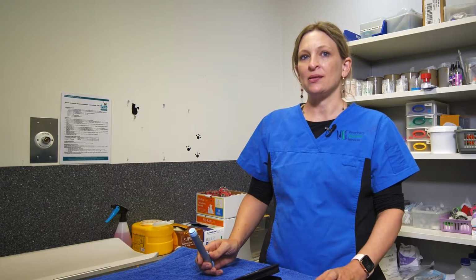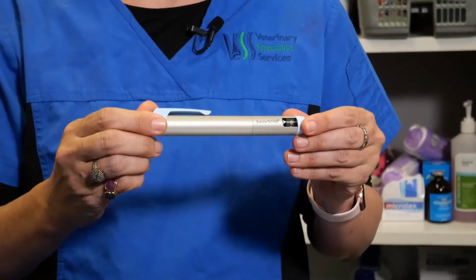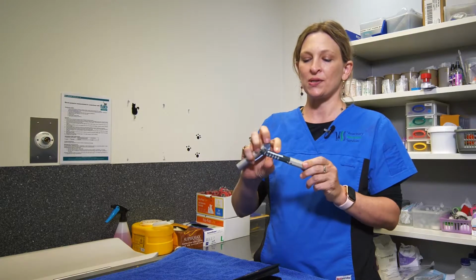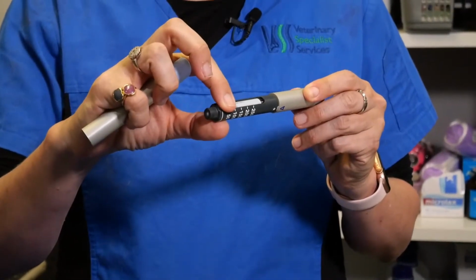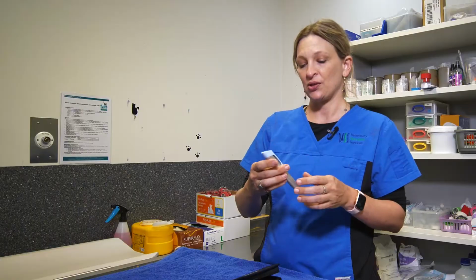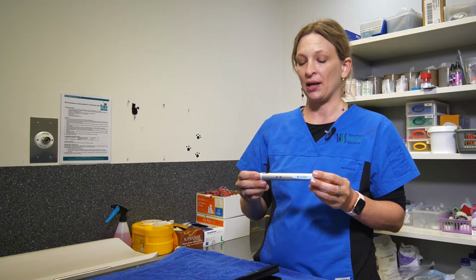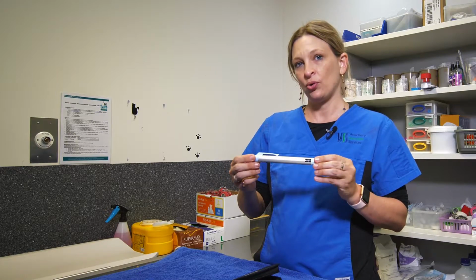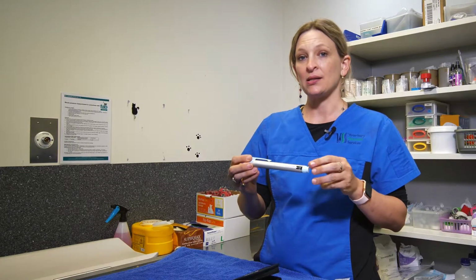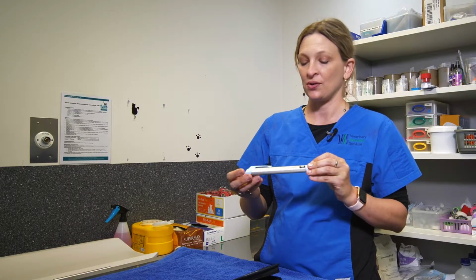There's three main pens that we use. This is the Sanofi Junior Star insulin pen for glargine, and it's a reusable pen, so you can purchase little cartridges of glargine that are then placed into the pen, and we'll demonstrate how to do that. You keep this pen for as long as your cat is diabetic. It's important that you don't put the pen into the fridge, as the cold of the fridge can affect the mechanisms of the pen, and that might affect the accurate delivery of the dosage of insulin.